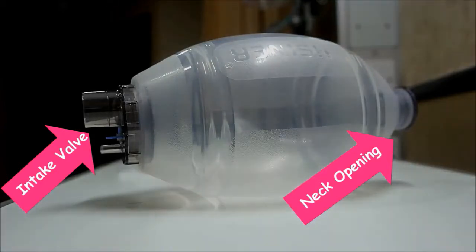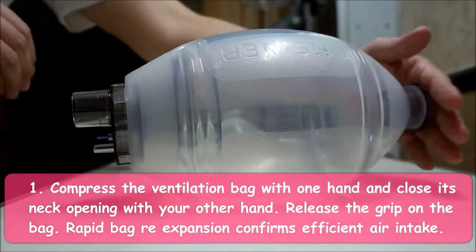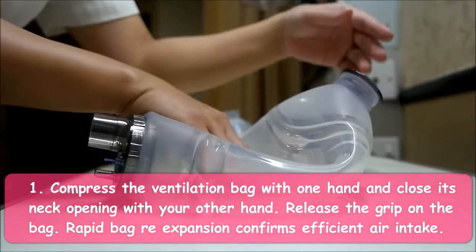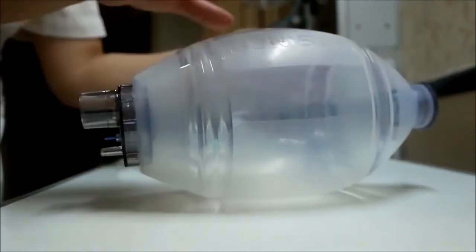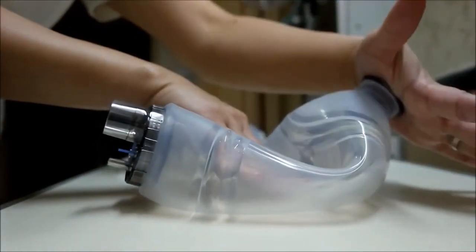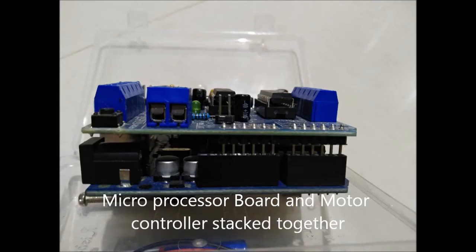It has a silicone bag, valve and mask. As you can see, the Ambu bag is a self-expanding bag made up of silicone material. Components which are required are an Arduino Uno, which is a microcontroller, a DC motor, 20 to 30 RPM speed geared motor, and a motor controller shield.